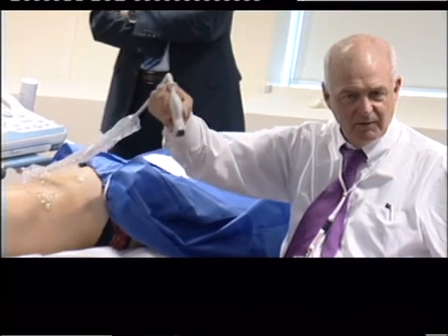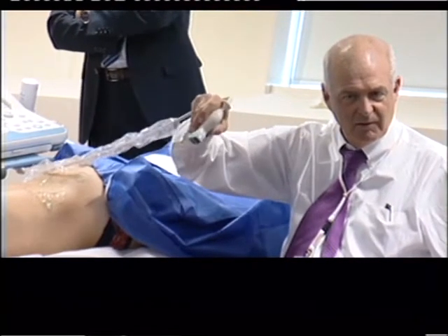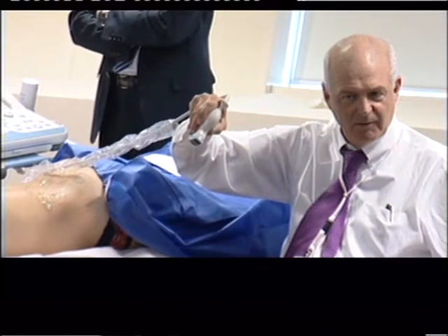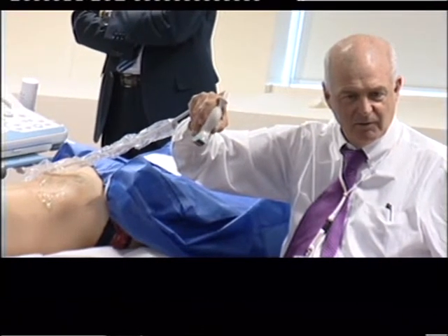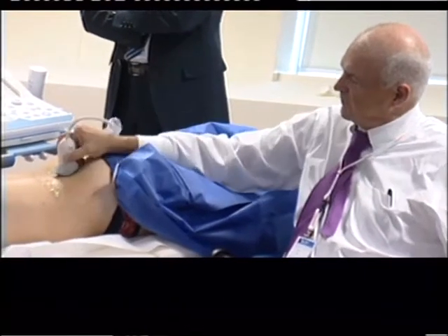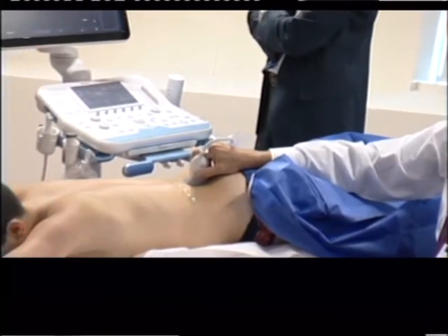People go too straight, and they just try and do this, where you need to come out: spinal, see a lamina, transverse process, or facet, nerve root, transverse process. We tilt the probe to find all these structures laterally.